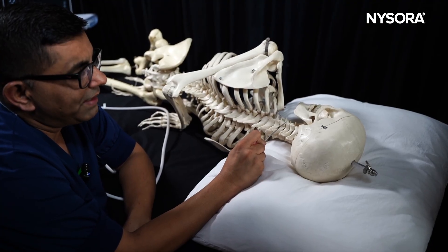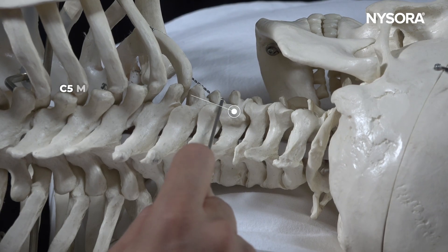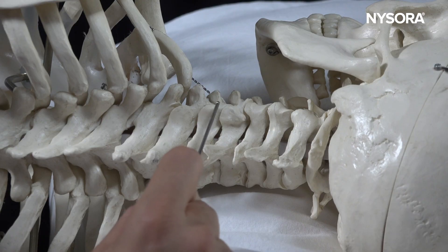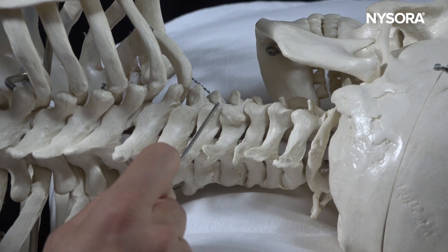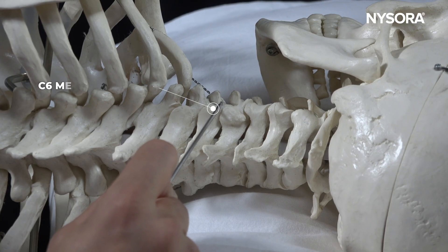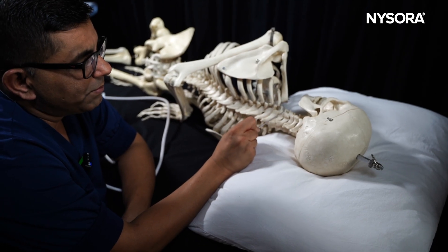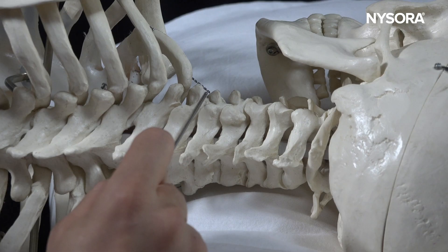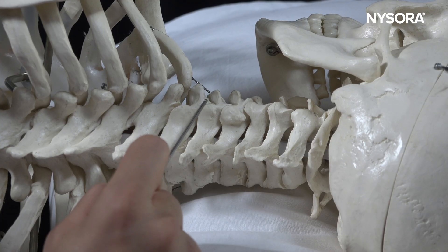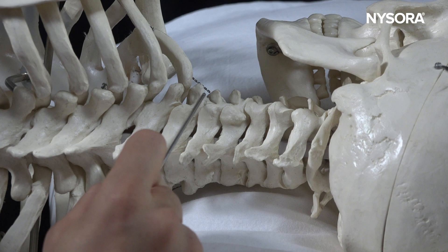At the C4-C5 joint, which is a peak, you then have the C5 medial branch. At the level of C6 and C7 things get different, because the location of the medial branch is slightly more medial rather than exactly in the middle of the trough. At the C7 level the medial branches are situated slightly higher rather than at the base of the trough.